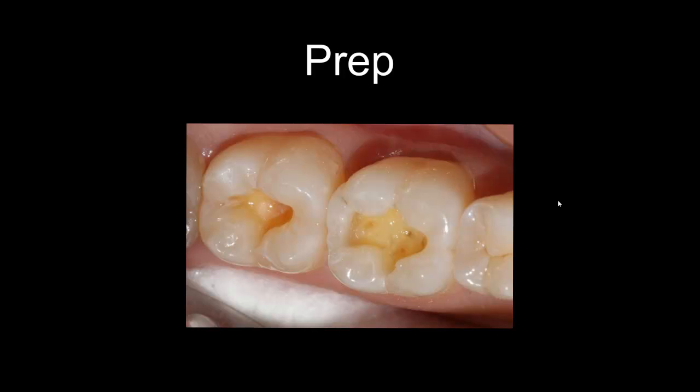For the cavity prep, I don't use a small cavity diamond bur. Instead, I use a football-shaped fine diamond bur and go around the margins of the preparation to create a slight bevel and increase the enamel surface area. Then I use phosphoric acid to etch the enamel, and I also use the PrepStart to clean the dentin surface area.